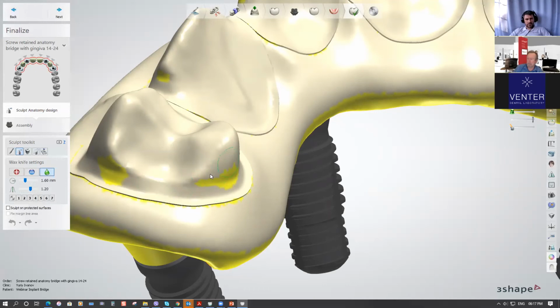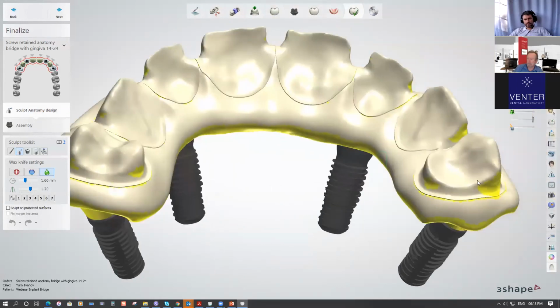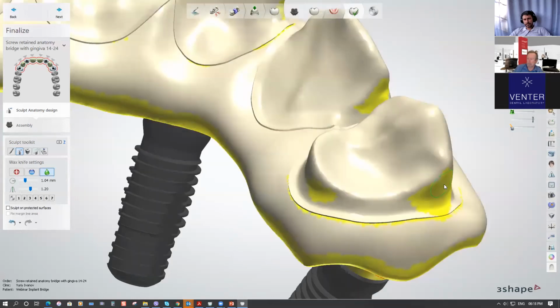to smooth it to avoid undercuts to be so close to the margin. Because it's no problem to have undercuts, but let's just minimize them to take them away from the margin line area. Yeah, like this. And we need to smooth it a bit to do correction. I prefer to smooth it, but also we could use any other tools to do it. Yeah, now it's much better.